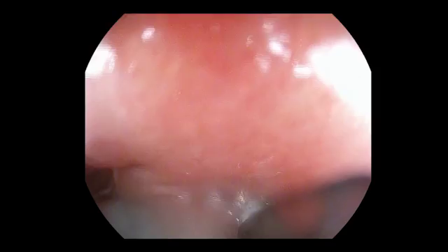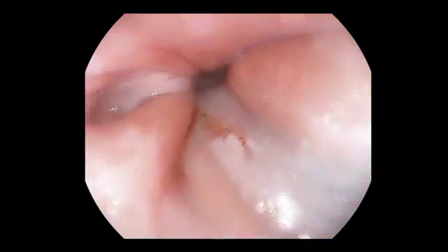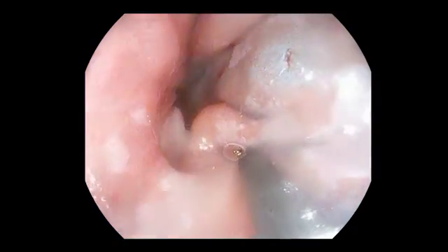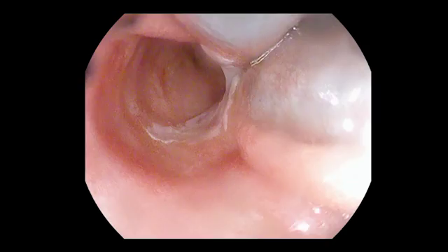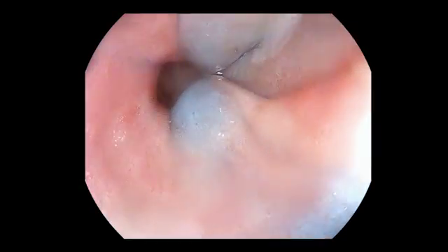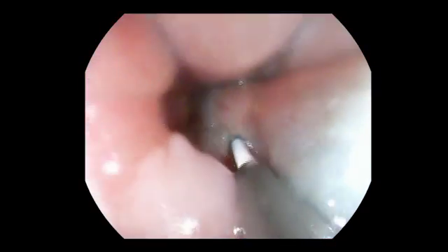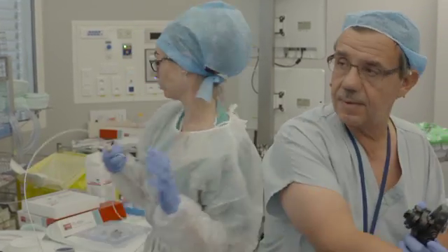It's quite a long Barrett. Needle out, inject. This area is now finished — needle out, inject. Okay, now I have injected on the half circumference and I will remove my scope.